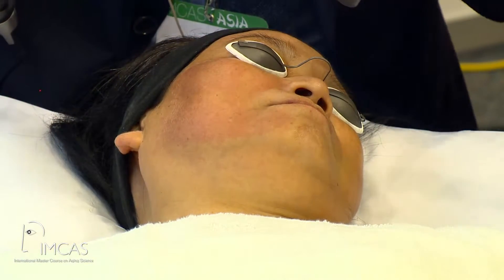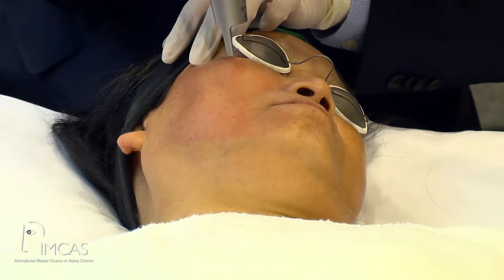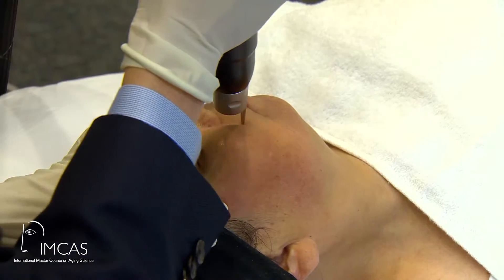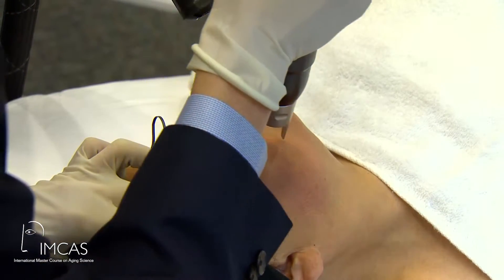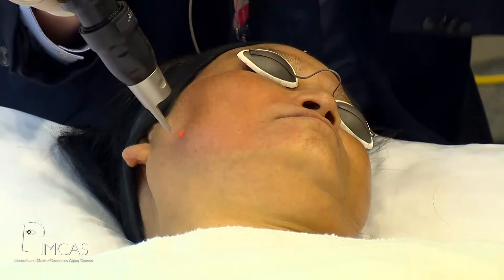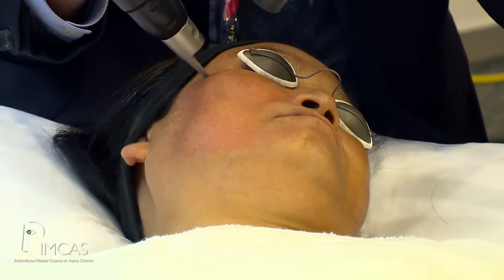You can see that after just two or three passes with the zoom handpiece, there is a nice but mild redness developing. I heard that some doctors are quite concerned with the redness that Dr. Lin created. To me, that kind of erythema is mild and you don't have to worry. After ice packing for maybe 20 minutes, 50% of the redness would go. For post-treatment care, sometimes just cooling gels and ice packing — nothing more.